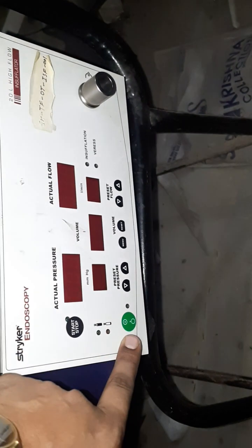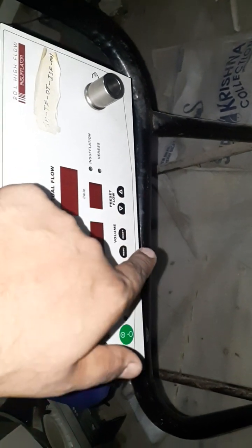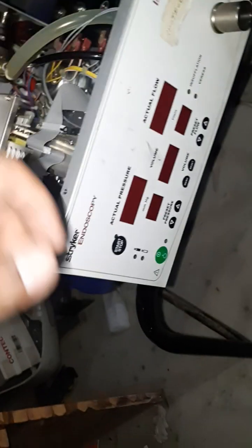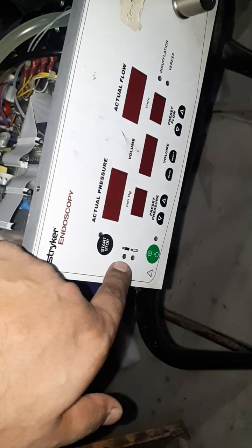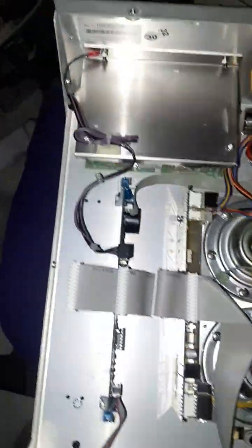There are some operational buttons. There is the power on and off button. There is the start and stop button for pressure startup, and after that there is the preset pressure control. There are the volume setup buttons, and there are the preset flow buttons. After that you can see here whether the insuflator is working or not, the green signal. If your insuflator cylinder is empty, then you will see the lower red color indicator. If your cylinder is full, then there is the green color indicator you will get here.